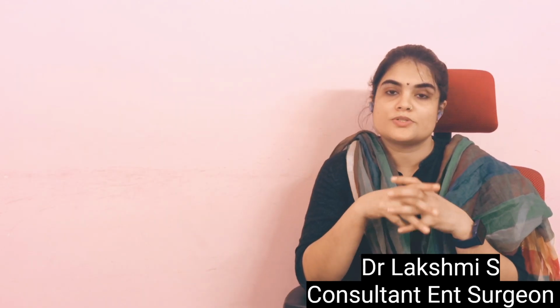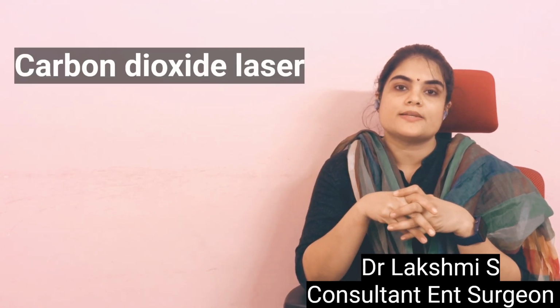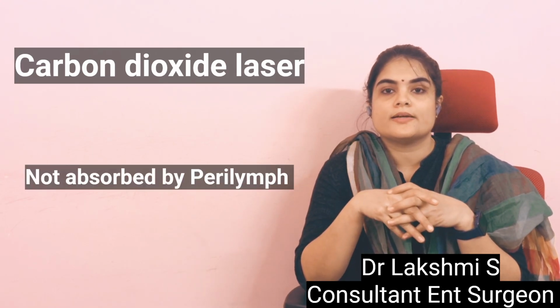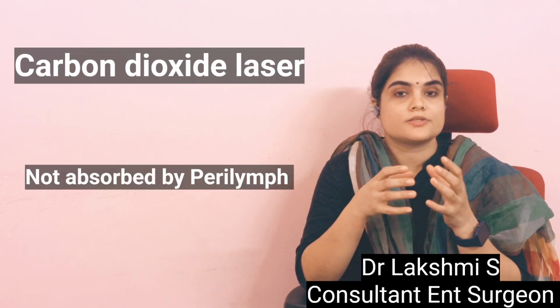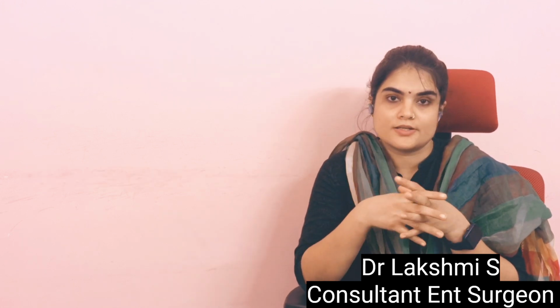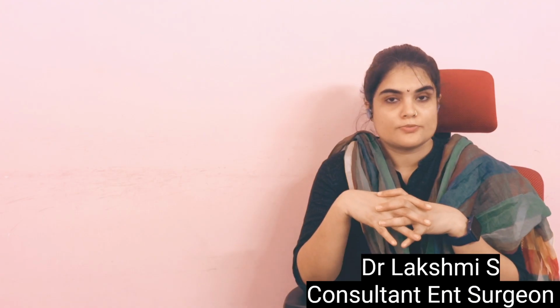Another laser that can be used is the carbon dioxide laser. The carbon dioxide laser will require an aiming beam. The thing about the carbon dioxide laser is it is not absorbed by the perilymph, and it is very useful to prevent any postoperative sensorineural hearing loss or giddiness for the patient. So laser can be used for the procedure.